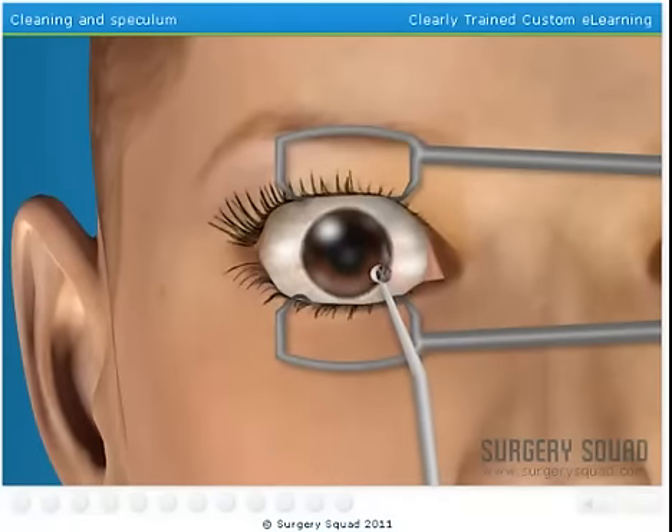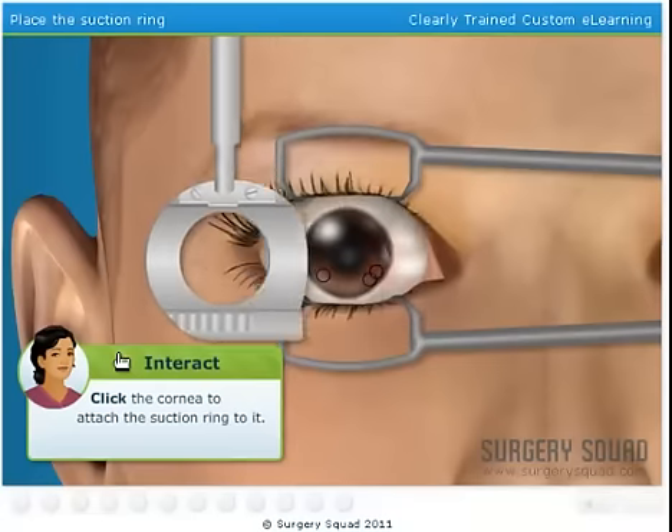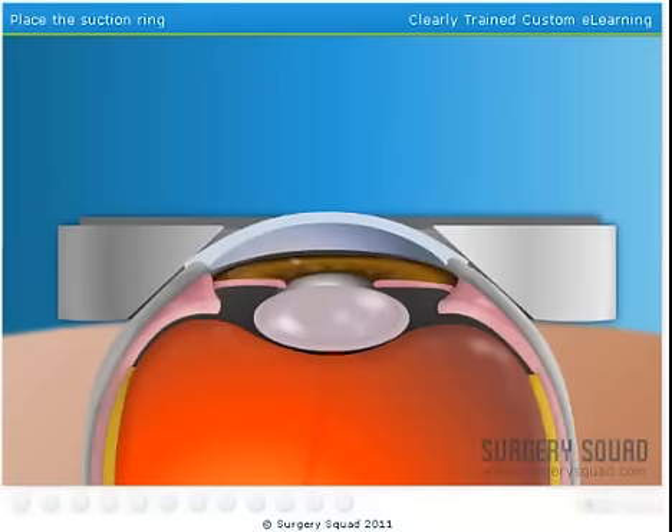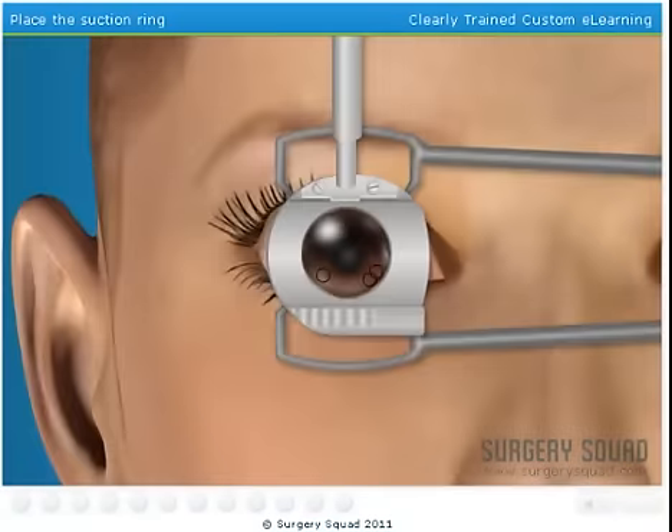At this point, we'll also mark the cornea with a water-soluble ink to guide replacement of the flap. Now we place a suction ring over the eye. The ring sucks the cornea upward, making it easier to cut. The patient's vision will likely dim and blur while the suction ring is attached.